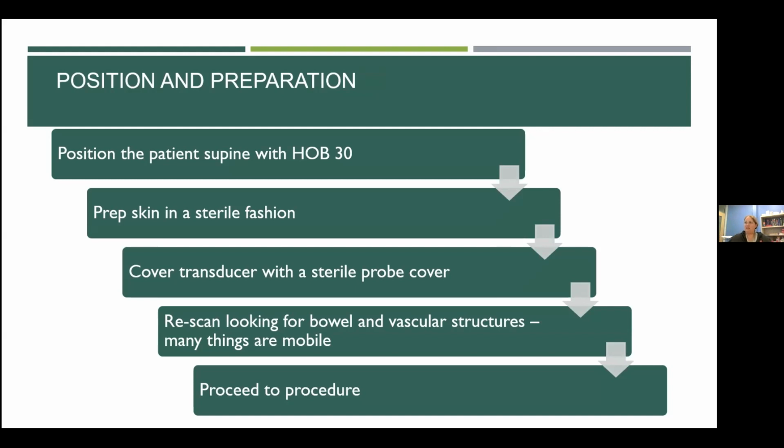If they'll tolerate that, you prep your skin in your usual sterile fashion. You're going to use your sterile probe cover and cover your transducer. And then again, right before you're about to stick for your procedure, you're going to rescan and make sure that things haven't floated around. Remember, your intestines, especially with fluid in your abdomen, are moving around quite frequently. So you want to make sure that the site that was safe 5 minutes ago is still safe. And then you go ahead and complete your procedure.